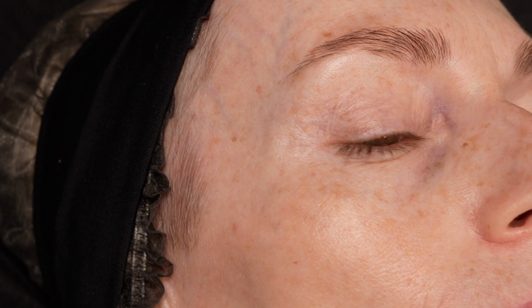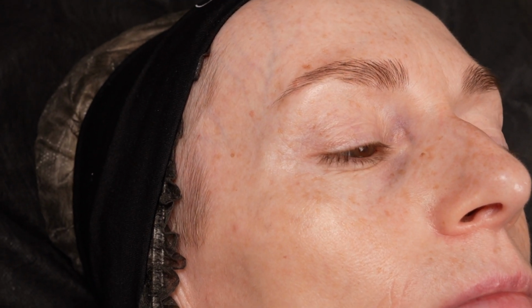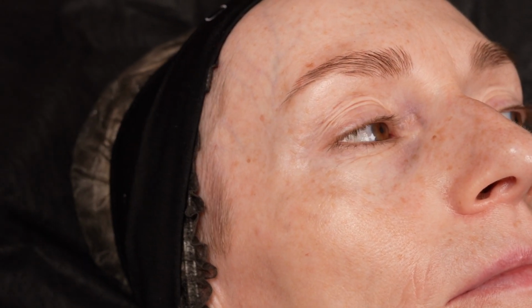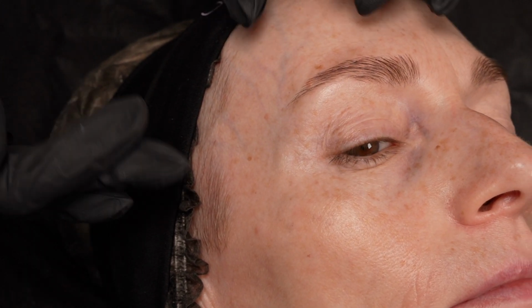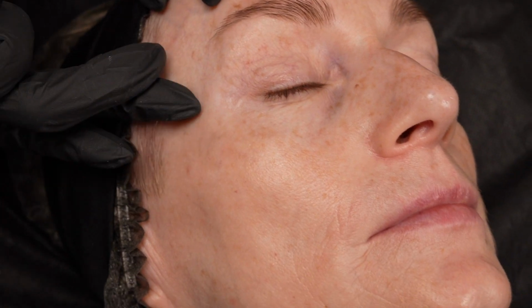Which part is your entry point? Do what you do. I will check. Так, разметку сделайте себе. Откуда вы начнете? Точка входа, да. She never worked with the upper face. She is good with the middle and lower part, but not with the upper.